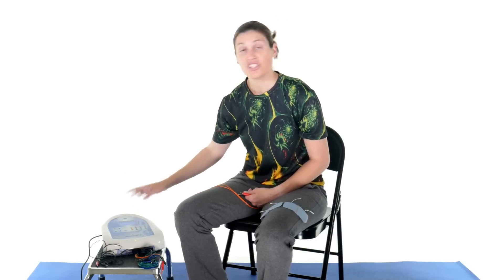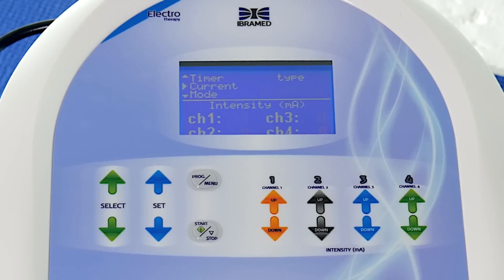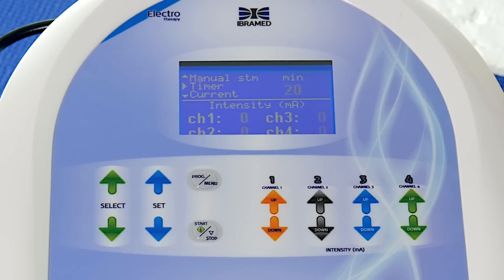The first thing is selecting the current you want: TENS, FES, or Russian current. There aren't a lot of buttons to press — you use select up and down, then set to pick your option. You can then set your timer, which goes from 1 to 60 minutes. For most electrical stimulation settings I'd say 15 minutes at the most. If you're doing Russian current, probably just 10 minutes because you're contracting that muscle so much. For TENS you might want it a little longer, but in a clinical setting this is just part of therapy, so maybe 15 to 20 minutes max.